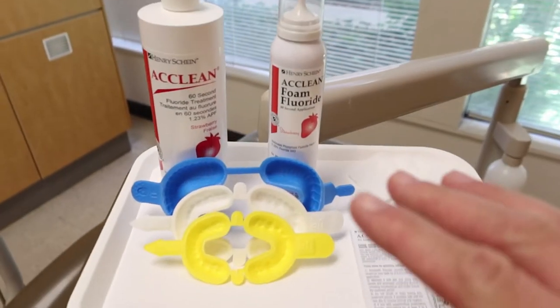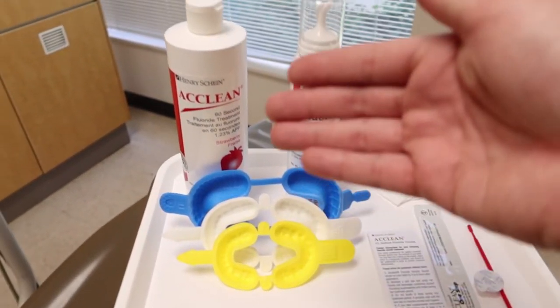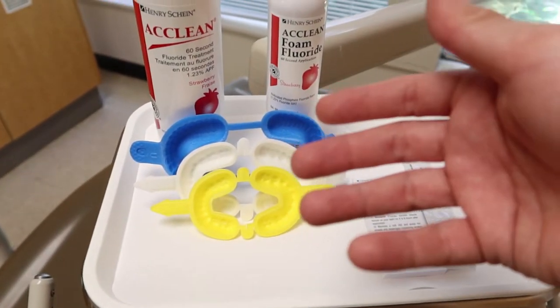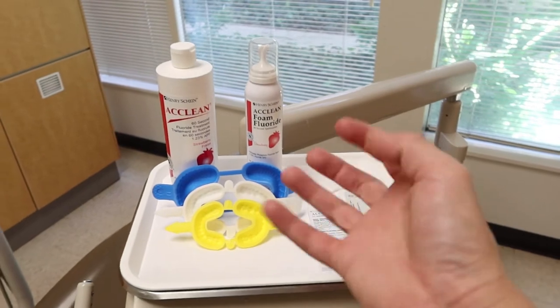Today we're going to be going over the act of using a fluoride treatment such as gels or foams, putting it in a tray and having that sit around the mouth for a while. But before we get started, as always, we're going to need something to protect ourselves, so let's glove up.